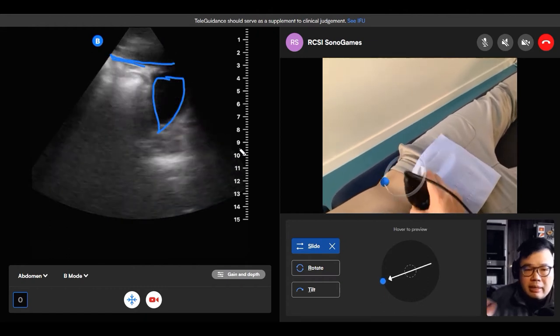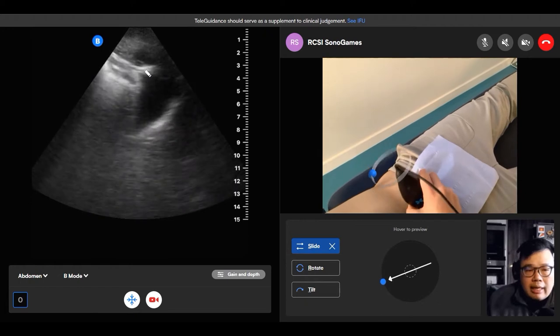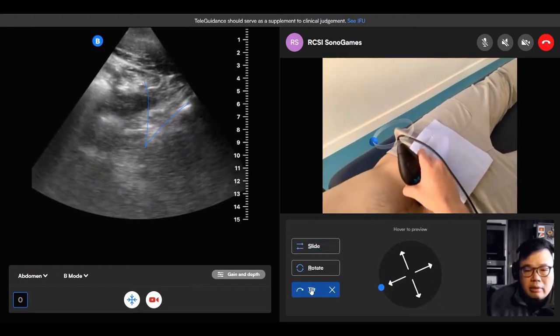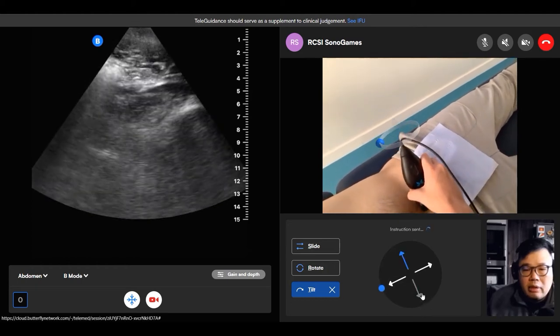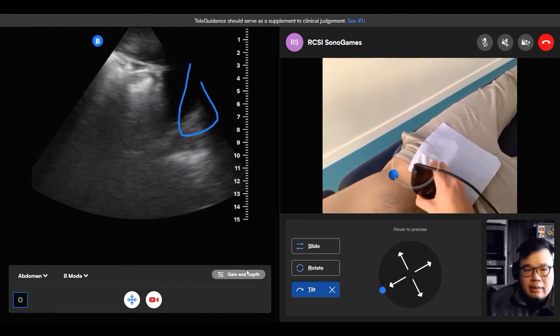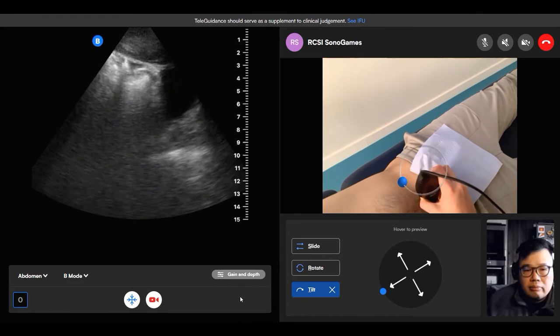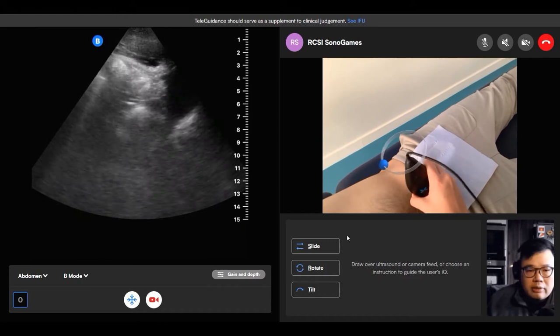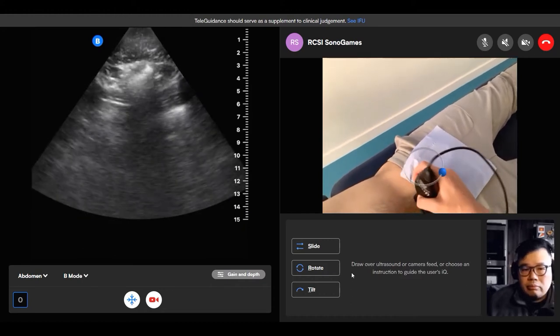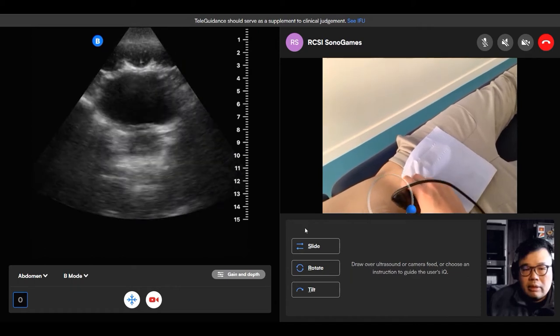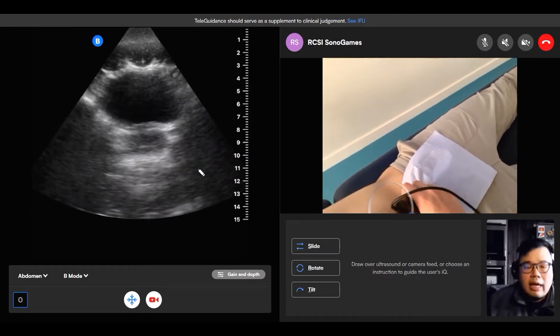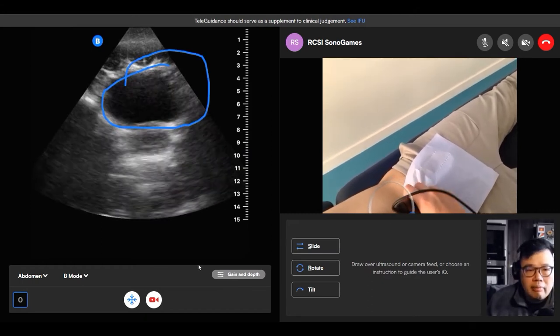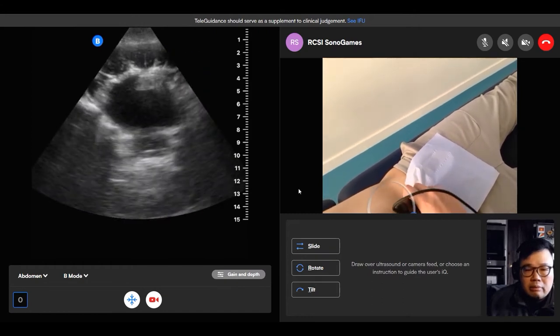So that's bladder there. And that's the peritoneum. So and then again, you can fan through that. So you're going to tilt the probe back and forth like that to clear this organ. And then you can do it in a kind of a transverse view as well. There we go. Yeah, that's it. What's this structure here? We said, isn't that prostate? Excellent. And that's the bladder. Perfect. So you've cleared the pelvis now.